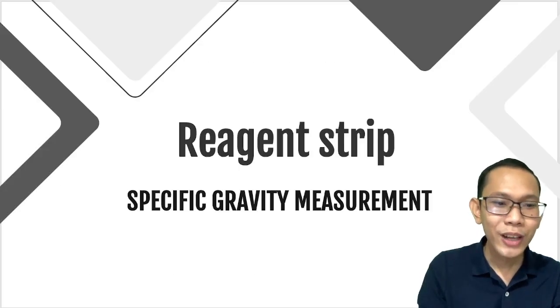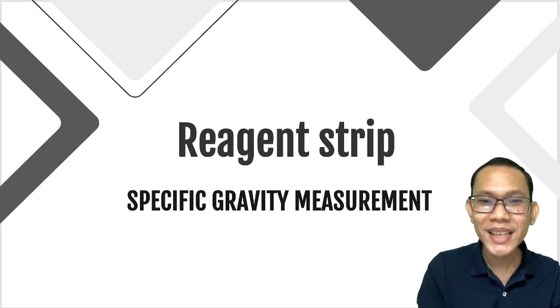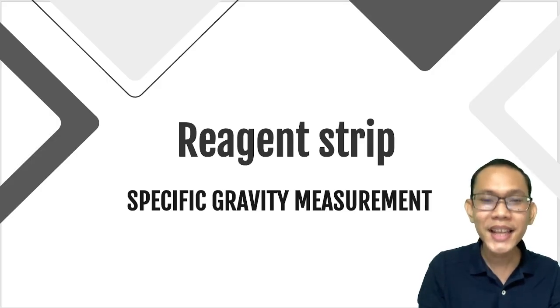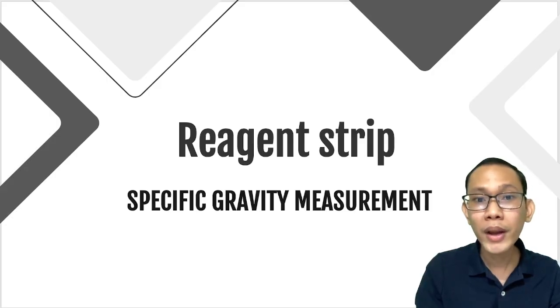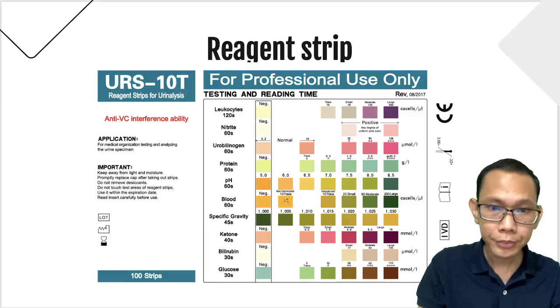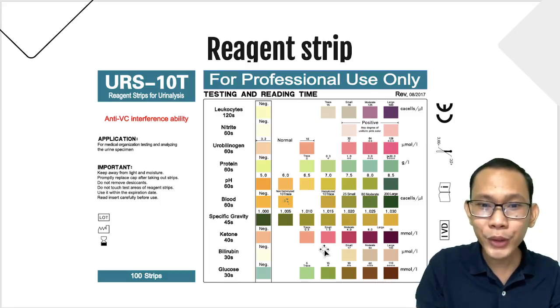Again, we are down to our last physical examination methodology ng ating specific gravity, which is your reagent strip. And again, as I said, ito yung pinaka-common na ginagawa na sa laboratory because this is very, very simple. So, this is now an example of your reagent strip.